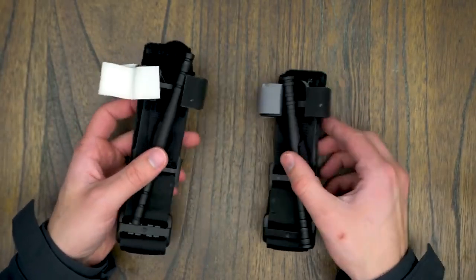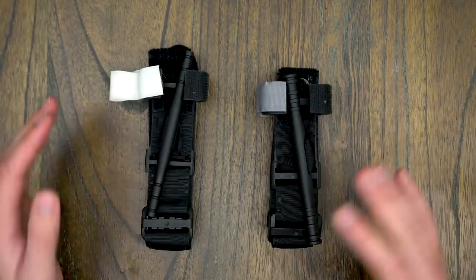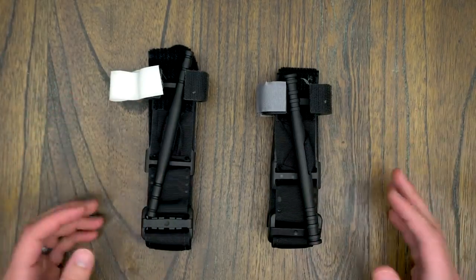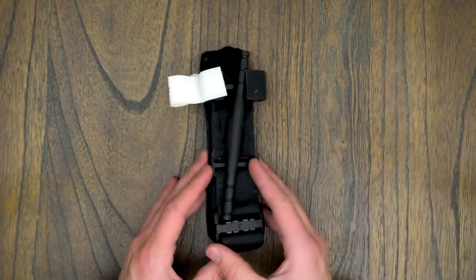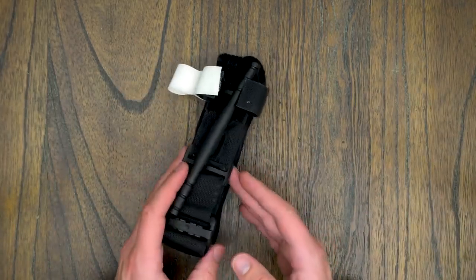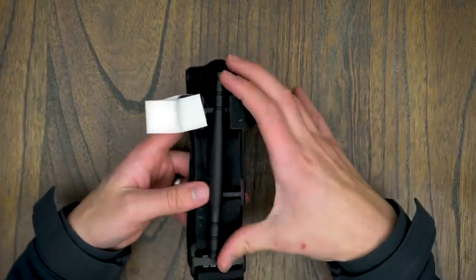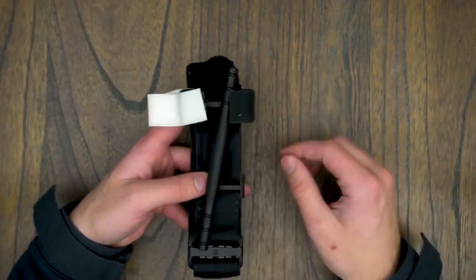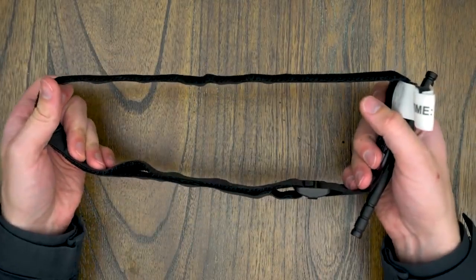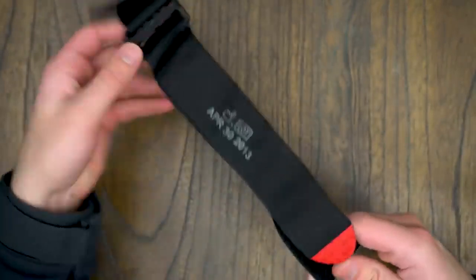So there are two main ways you can fold a tourniquet, and both work fine. It's just kind of your preference and how you have to store these. The first way to fold a tourniquet, and this is the classic way that you'll see on North American Rescue's website, is you have the tourniquet in front, the windlass up and down inside this bracket, the time strip pulled off to the side, and then in the back, it can just open like that, and you can put that around an extremity really fast. So I'll show you how to do this really quick.